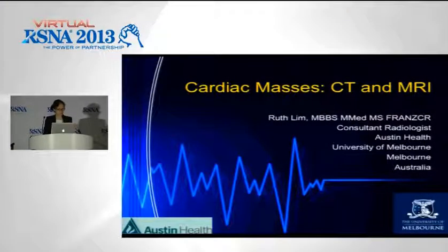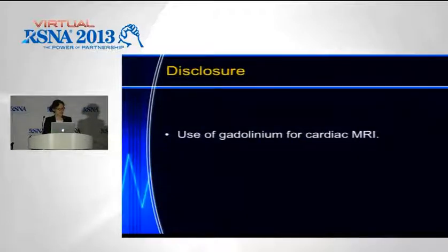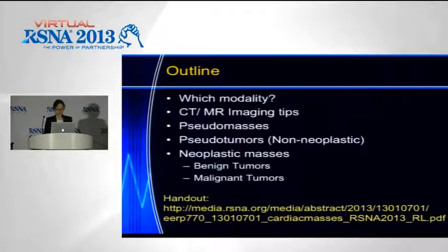I'm going to talk a little bit about cardiac masses. And just a disclosure, I will be talking about contrast use in cardiac MRI, which is off-label, and I have no financial disclosures.